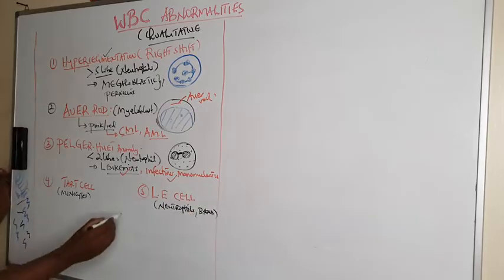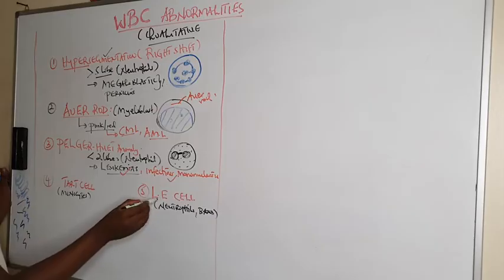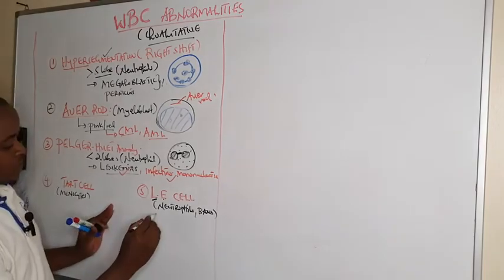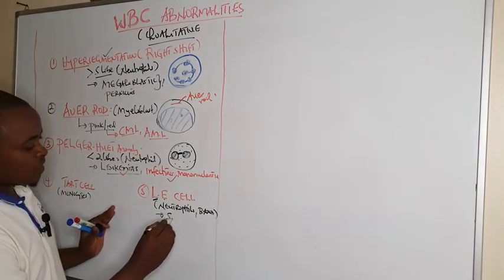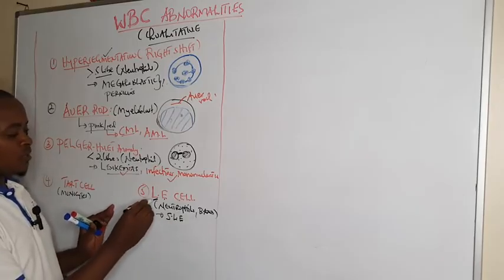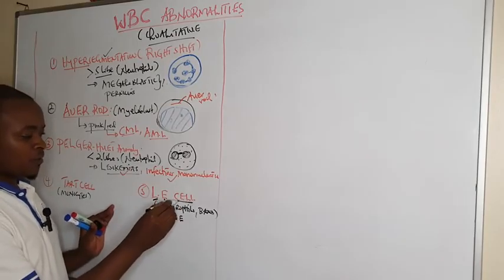So this is lupus erythematosus. You can find it in systemic lupus erythematosus. So this is the lupus erythematosus cell.